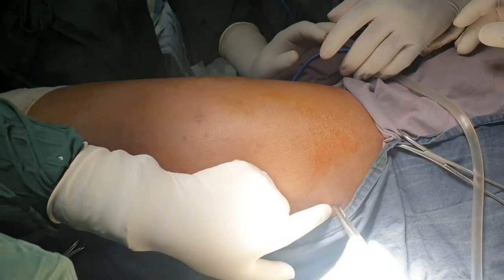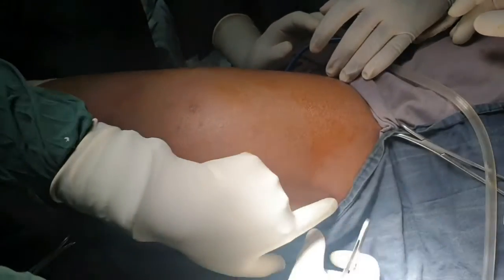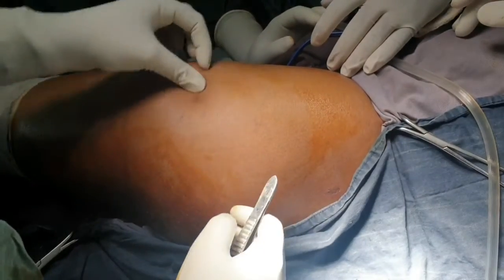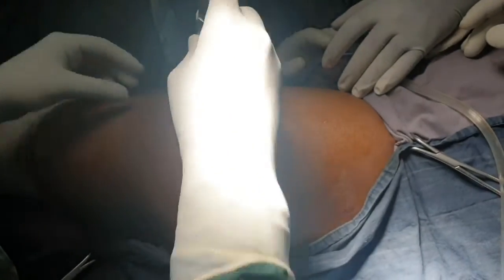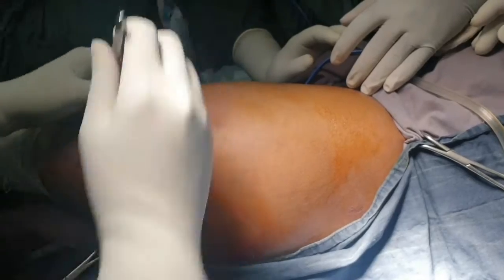So these are the landmarks. This is the posterior superior iliac spine. This is a point. This is the tip of the greater trochanter. So this is our second landmark, and this is the shaft. So this is the third landmark.